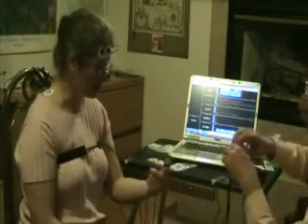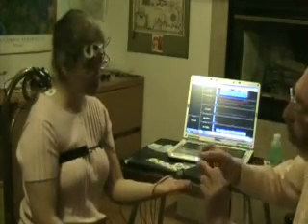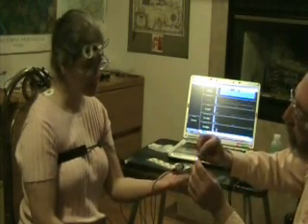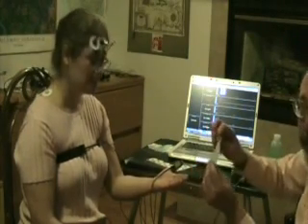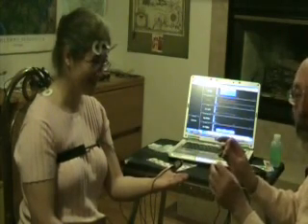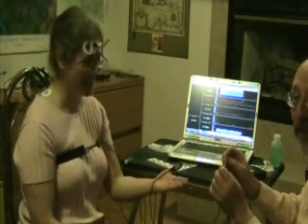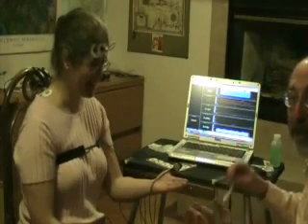Now, what I didn't demonstrate to you was that when I went to put the tape on, as I was closing it, I made a little cuff right like this so that I can find the end of the tape, because there are few things more embarrassing than finishing a session like this and not being able to get anything off because you can't find the ends of the tape. And eventually you simply grab the nearest axe and start chopping out of desperation.